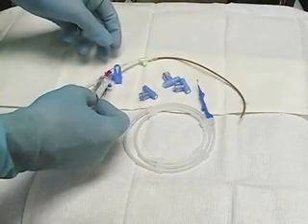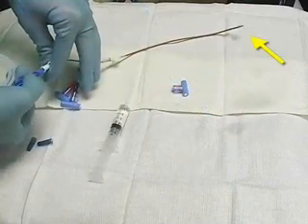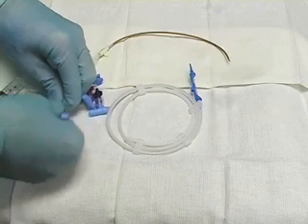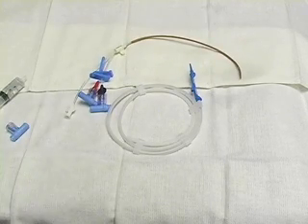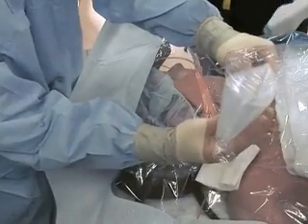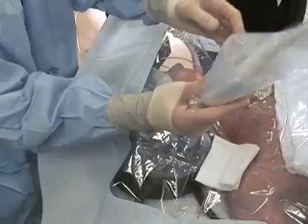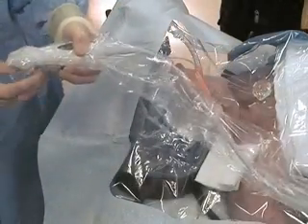Flush the lumens of the central line with saline or heparin, and ensure that the guide wire threads easily through your needle. Remove the cap from the port through which the guide wire will be threaded. This is commonly the longer lumen. If using ultrasound, prepare the ultrasound probe with a long sterile sleeve, being careful not to contaminate the sleeve prior to placing it on the sterile field.